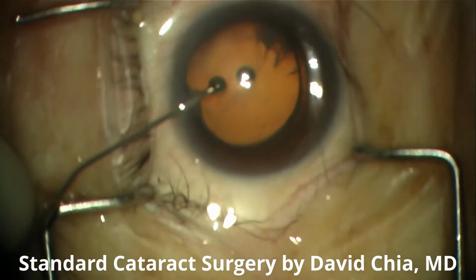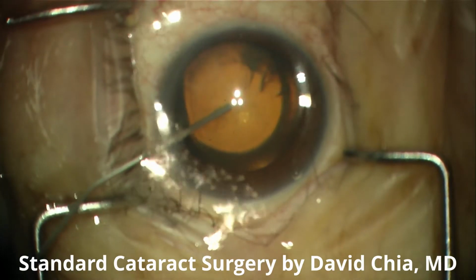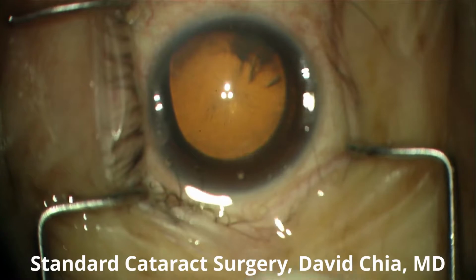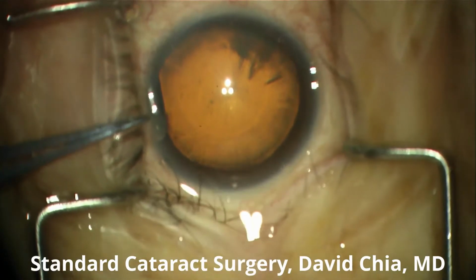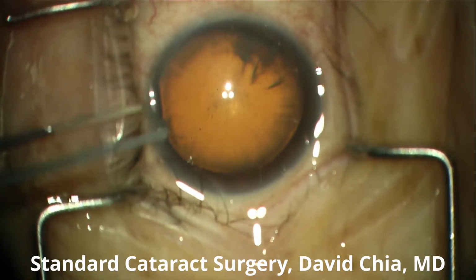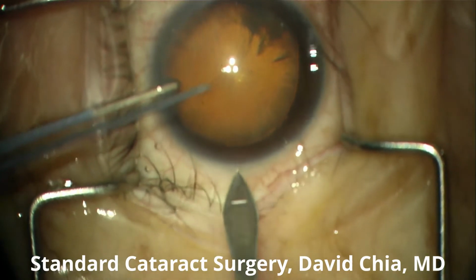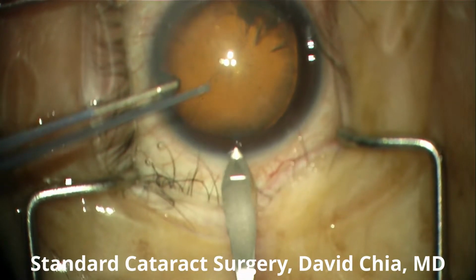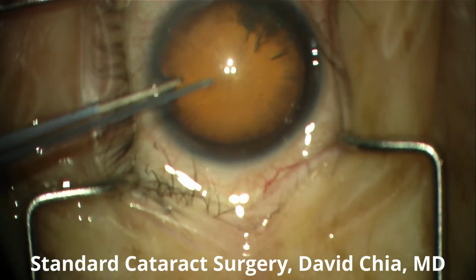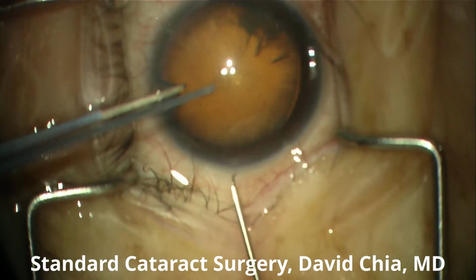Following this is a dispersive viscoelastic that is used to protect the corneal endothelium during the operation. Following this, we'll be creating the main incision, and this is created at the temporal limbus and is approximately 2.4 millimeters in size. This will create access for the removal of the cataract. So with these two incisions, we've now set up the main incisions in the cornea.